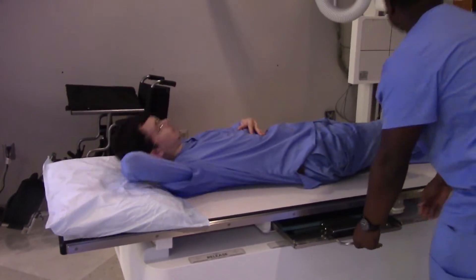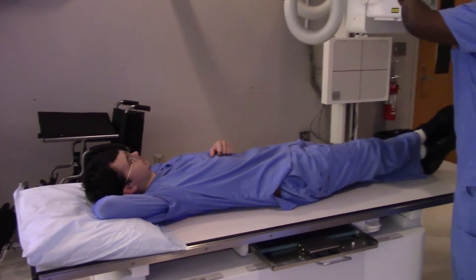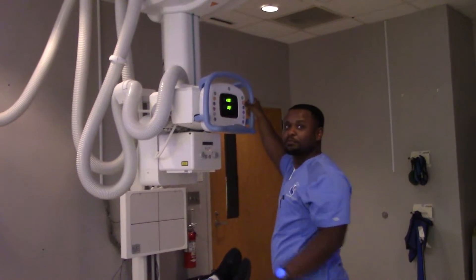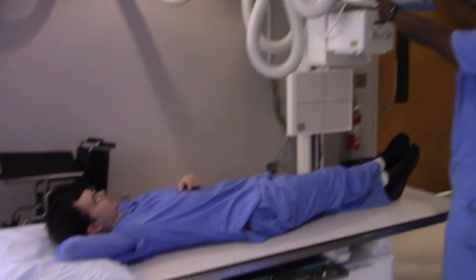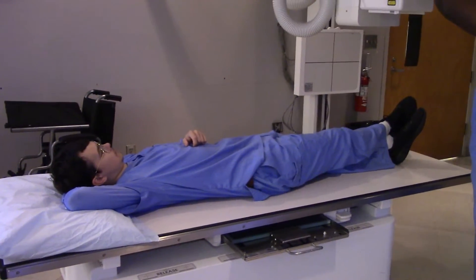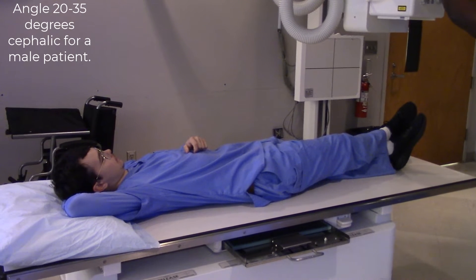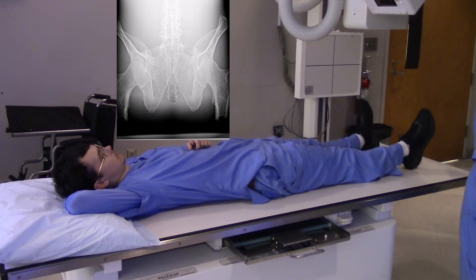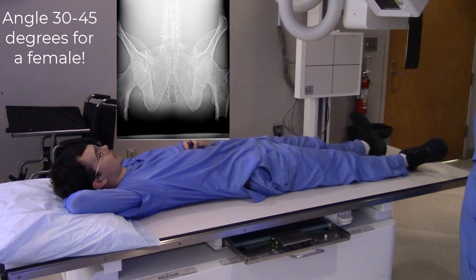Alright, so what is it we're doing here? We are doing the outlet view. The outlet view. Very good. So this is going to be the opposite of the inlet view. This is the outlet view of the pelvis, showing primarily the pubis and the ischium.